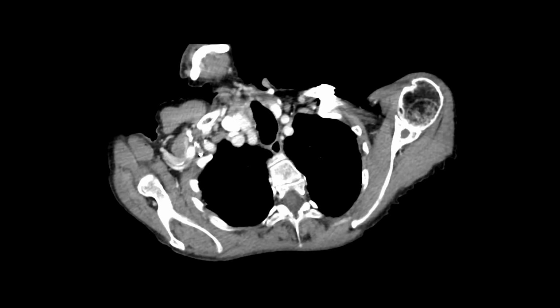I've got a really cool case for you and I just want to get right into it. I want to explain how we kind of solved this case because this is not something that is routinely requested. So a patient had surgery on their left clavicle and they were worried that they somehow maybe damaged the subclavian artery or vein on that side. And so a patient came in for the scan, and usually that's not that big of a deal, I guess, except there's a huge metal plate going across this patient's clavicle, which is going to give you a lot of artifact.